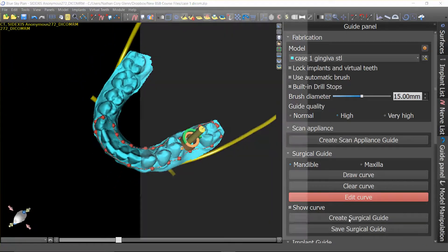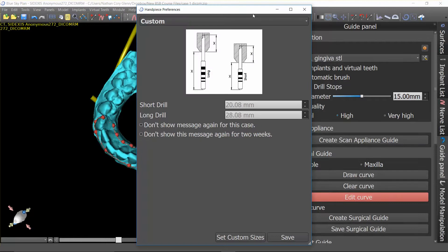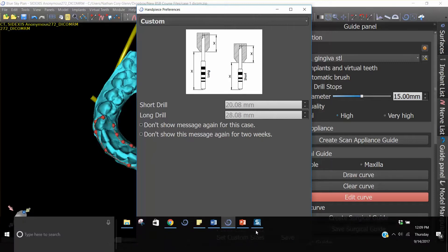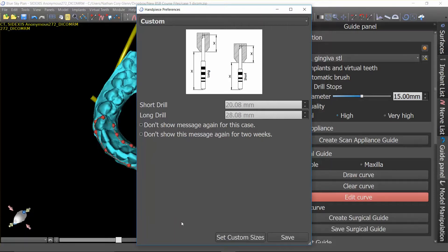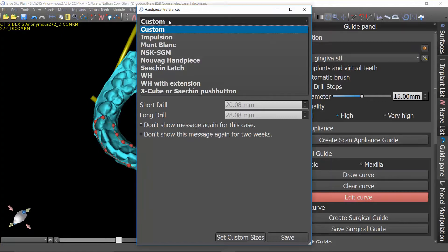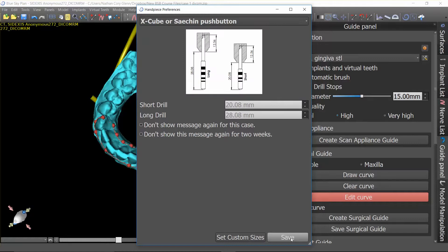Once you're satisfied, push create surgical guide. Because we're using the Blue Sky single cut drills, it matters which handpiece we're using — you need to tell the software which handpiece you're using. The handpiece is actually the vertical stop that bumps into the head, and since every handpiece swallows a different amount of the shank of the drill, you need to specify which one you're using or input custom numbers. Let's say we're using the X-Cube handpiece — it will program everything automatically.